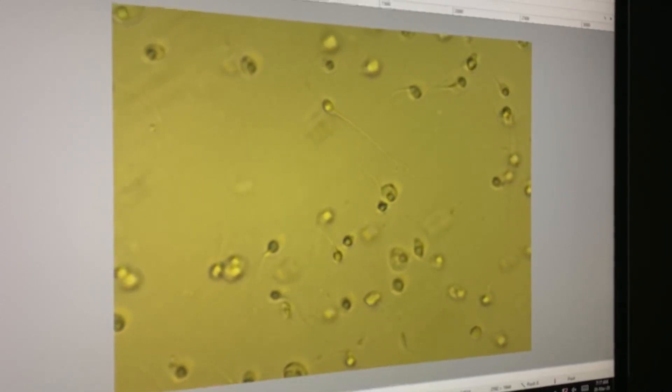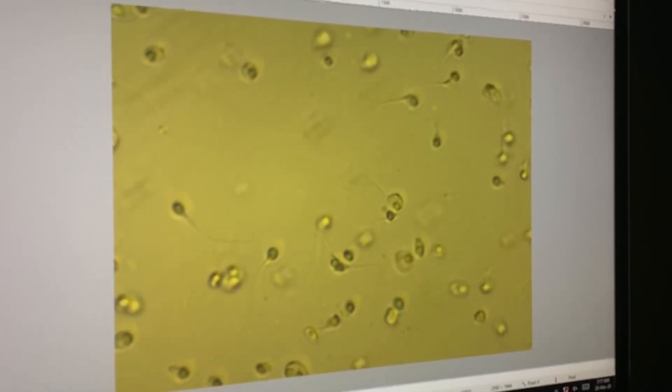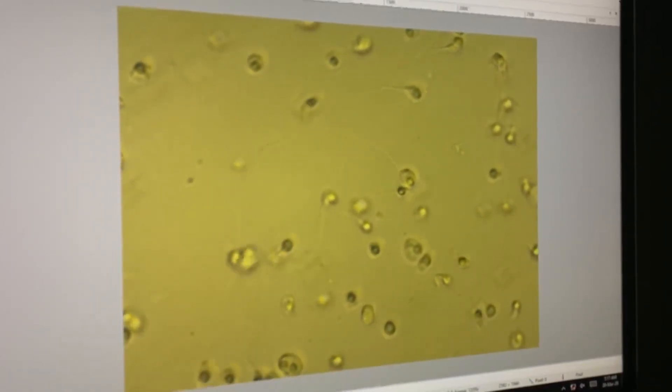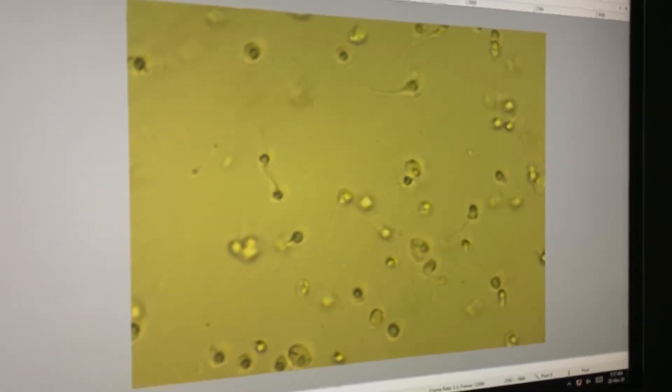About 85% of the sperm are showing the same abnormal characteristics. You will find this in globozoospermia, and you will find less than 1% of male infertility in this group — mostly round heads without acrosome and abnormal nuclear membrane.